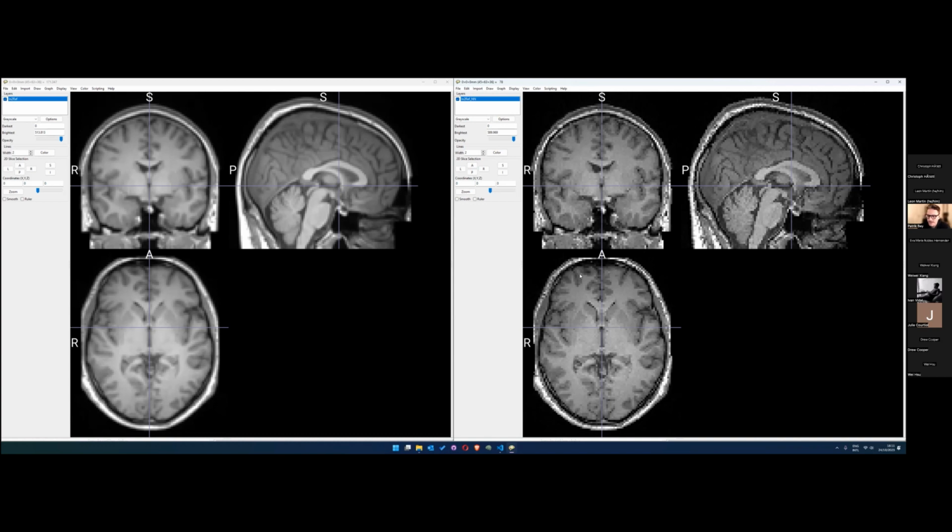So we can think of these small steps actually being carried on again across the whole processing pipeline and up to the downstream analysis at the end, to really have an impact and to really be something that we need to be aware of in terms of where group differences, for example, might come from.